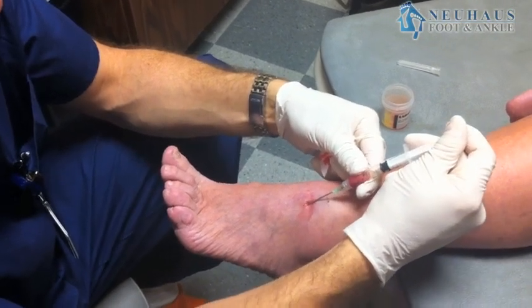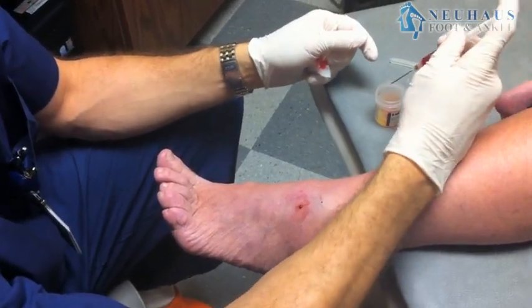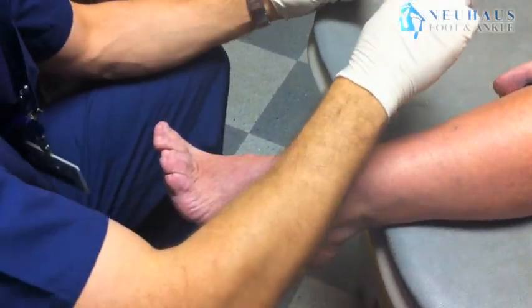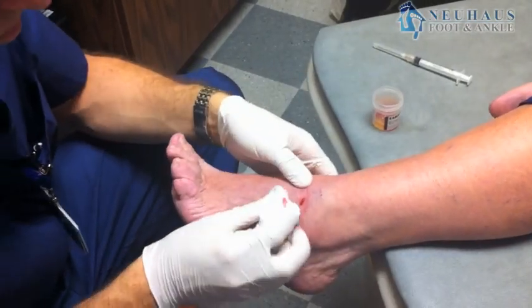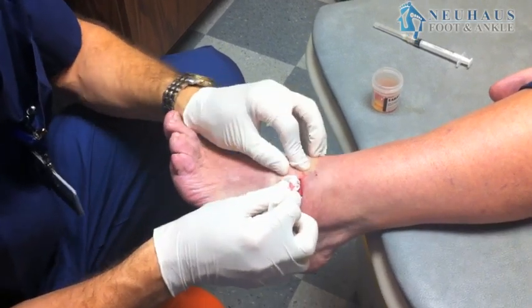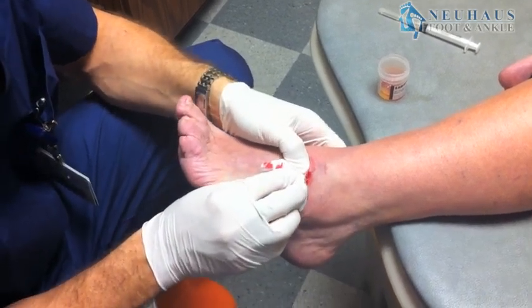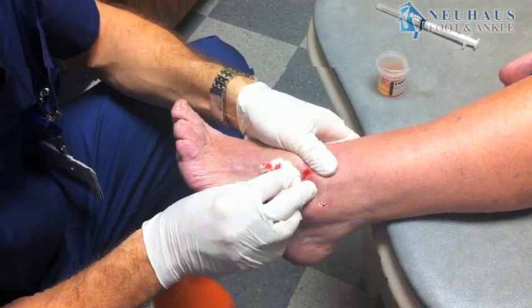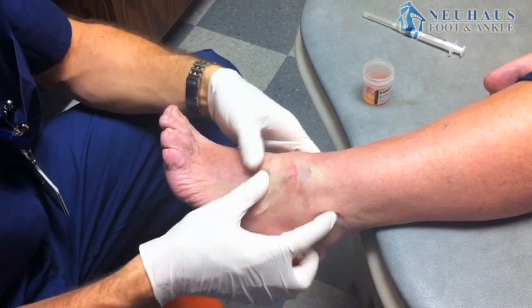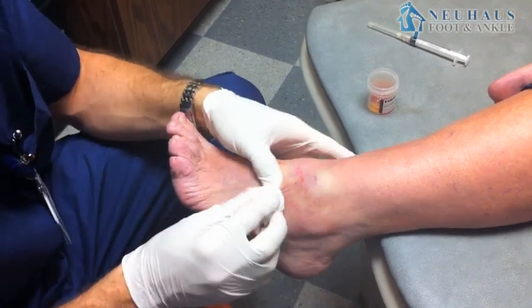It makes almost a little water balloon on the inside. The purpose of draining it is to not only remove the fluid but to pop the cyst and get that fluid to leak out and get the body to heal itself. Typically we'll numb the area up, drain as much fluid as I can. There are typically chambers so we try multiple different angles and squeeze it. This is actually a fairly large cyst — usually we don't get this much out. A very common area in the foot is right on top of the foot, where somebody's banged it or a shoe has been tight. It's the front of the ankle or the top of the foot.